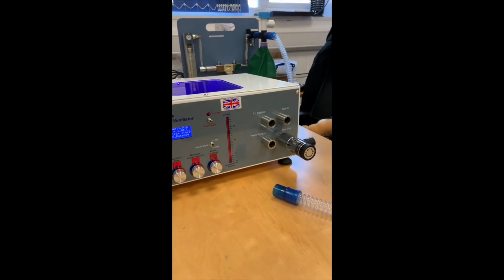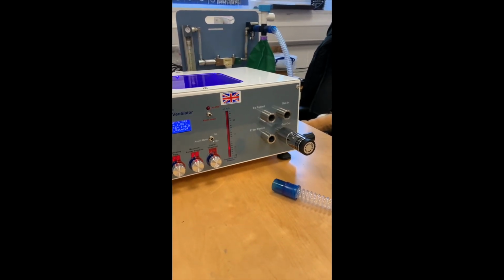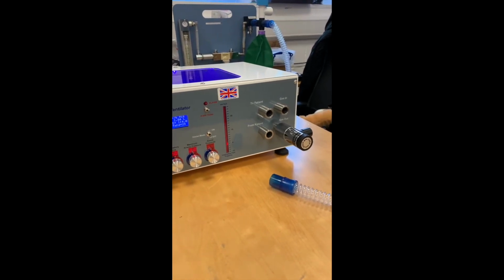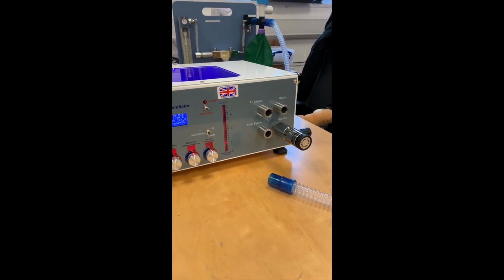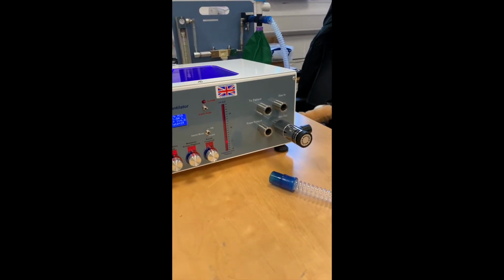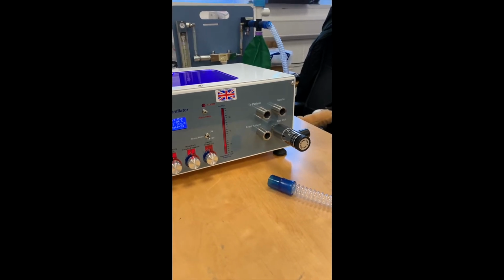The reservoir bag needs to be about double the capacity of Merlin, so about 2 litres. If the fresh gas flow exceeds the minute volume requirement, the excess gas is vented by the APL or adjustable pressure limit valve. In non-rebreathing mode, waste gas is simply directed to the scavenge system from the gas output. As you can see here, we have a PEEP valve attached on the gas output so that we can achieve any value of PEEP that we require. We will come back to that.